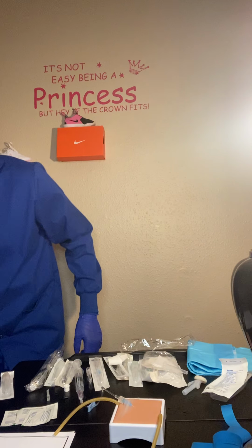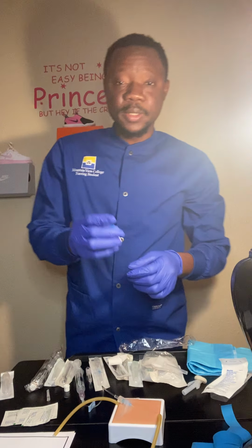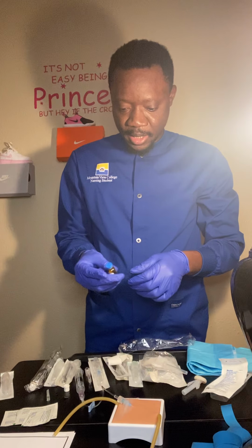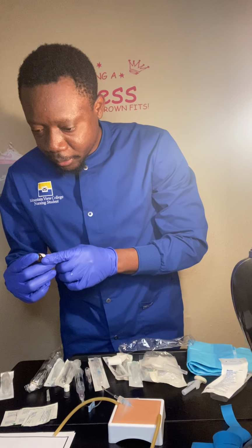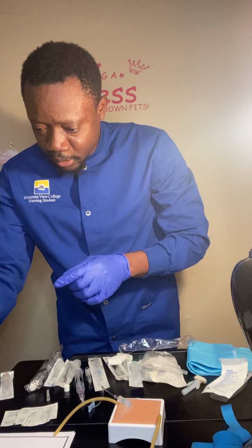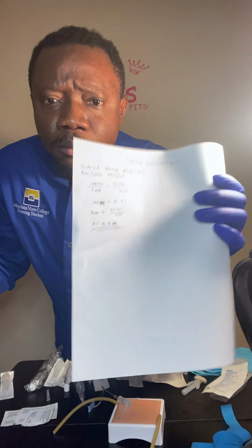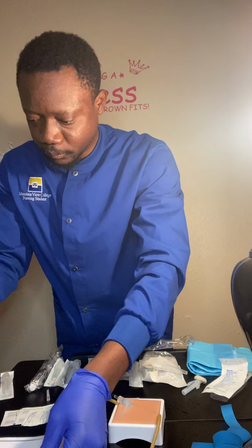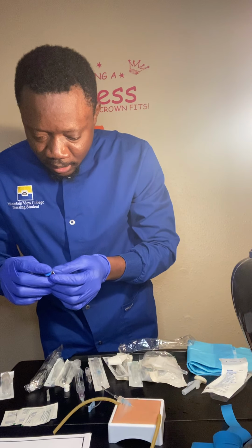Once I'm done with my flushing, okay, I'll go ahead and get my medication ready. Okay, so now it's time for me to do my second check. I have my meperidine, I have my right medication, I have my right dosage, and medication calculation, 0.5 ml, right time, right patient, right route.